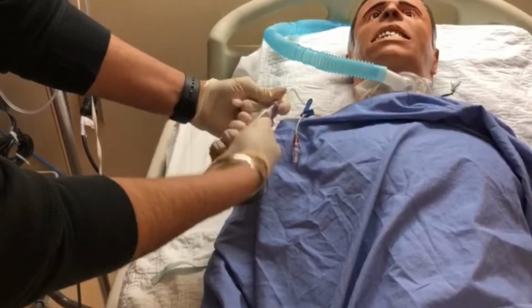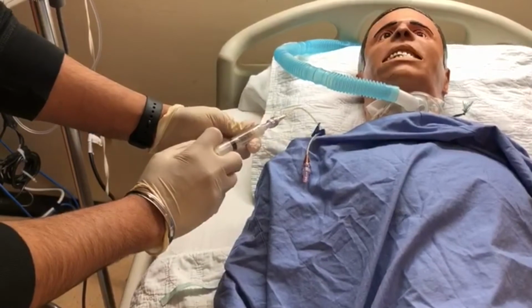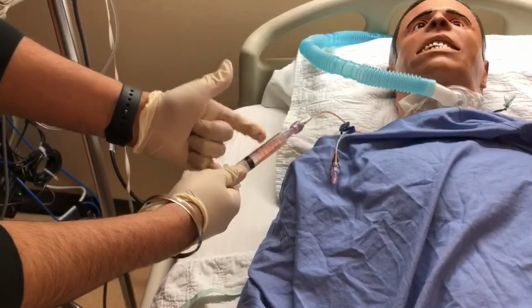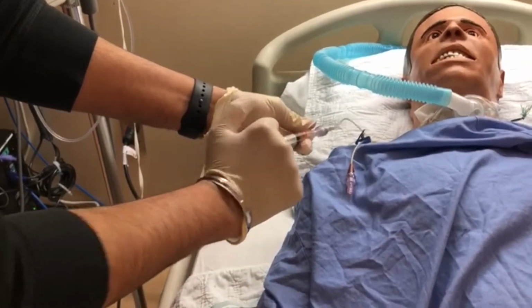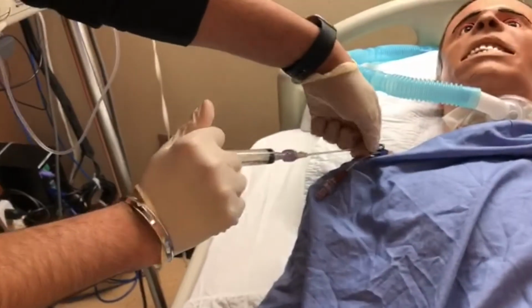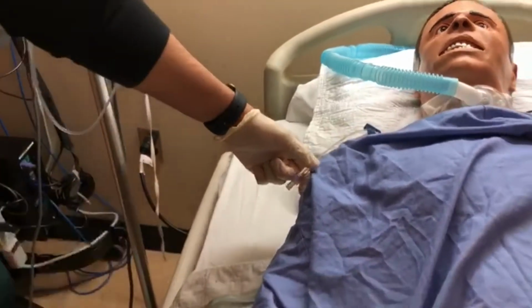Attach this. I can unclamp this portion. I would flush 1 mL, draw back for fluid. We see fluid coming back, or blood draw back, and then we would push the rest of the fluid into there. And we could close as we do that. So that's good to go. We know that's patent and intact.